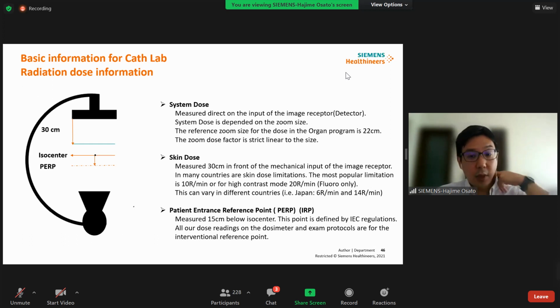Therefore, one solution is to switch to the high contrast mode. The system supplies more power due to the increased limitation value. While using the high contrast mode, the system will sound an audible alarm.